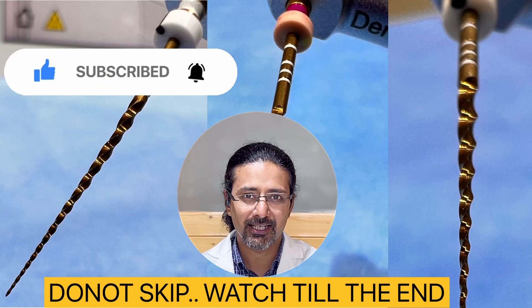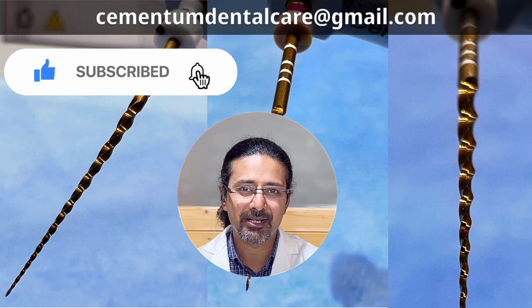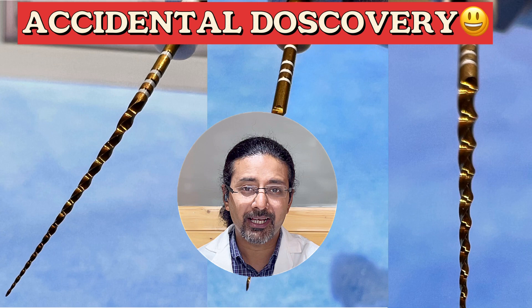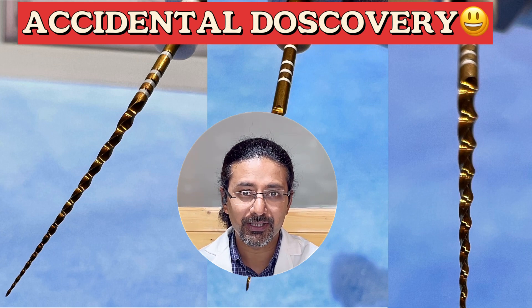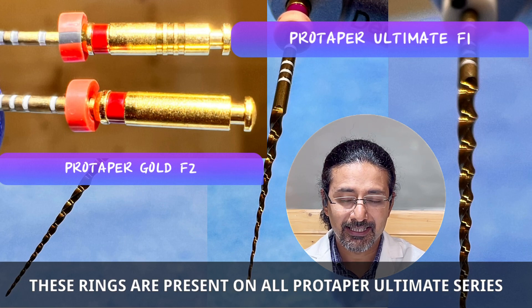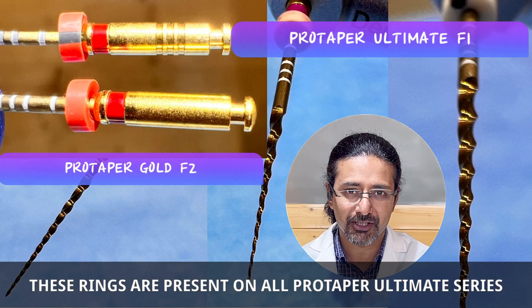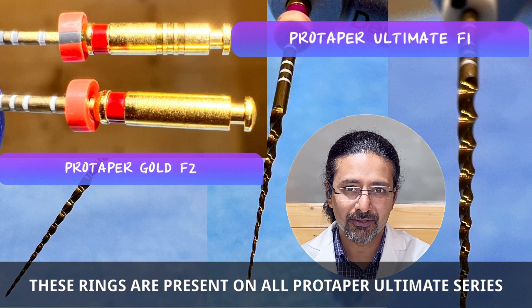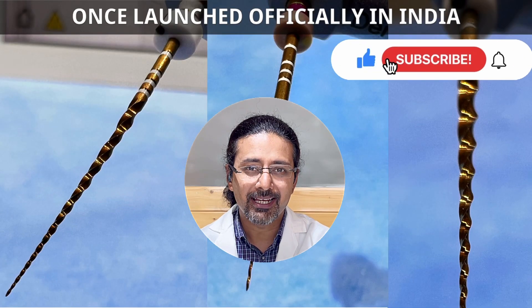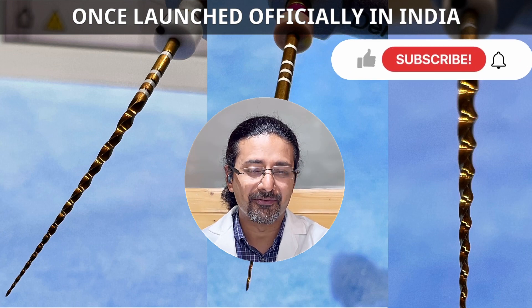Hope you guys enjoyed this unboxing and overview. Stay tuned, stay happy, stay healthy. For any questions and queries, you can always write to us at cementumdentalcare@gmail.com. One thing I want to share: a couple of minutes ago, while removing the file from my Endo motor, I could see 3 concentric rings on the handle of the Pro Taper Ultimate files. I think this makes it unique and different from Pro Taper Gold Series — just a differentiating feature, so no need to get confused. Results and reviews will be posted soon once these files are officially launched in India.